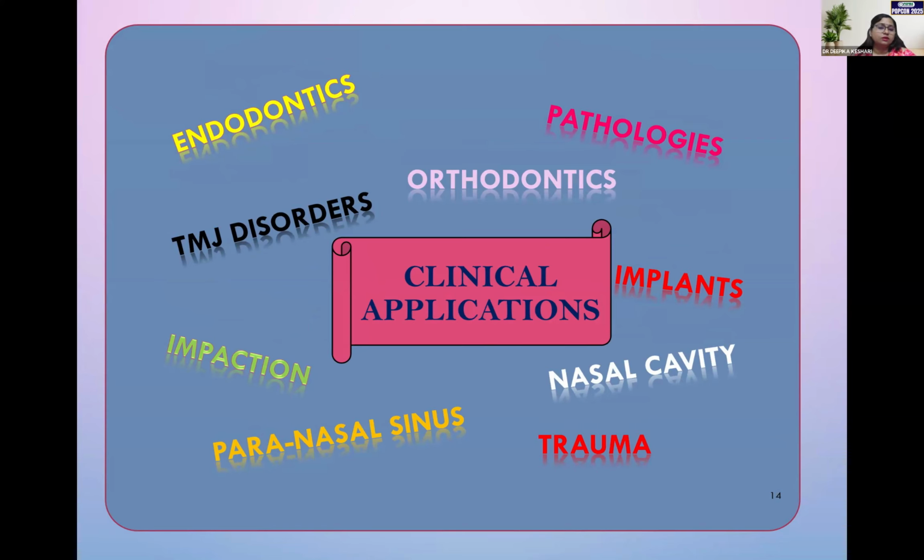CBCT is helpful in evaluation of pathologies in orthodontics, TMJ disorders, endodontics, impactions, paranasal sinus disorders, salivary glands, nasal cavity, trauma, and also in implant planning. We will mainly focus on the pathology part of it.